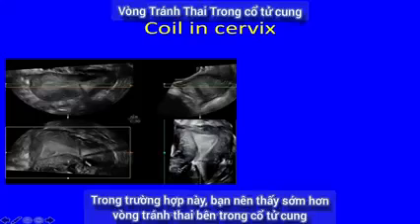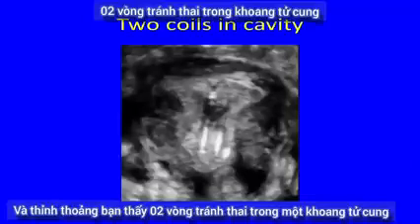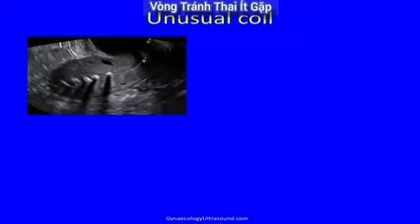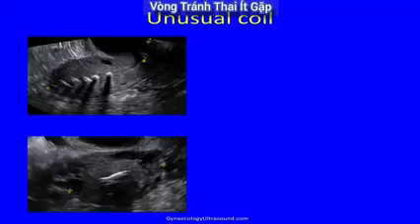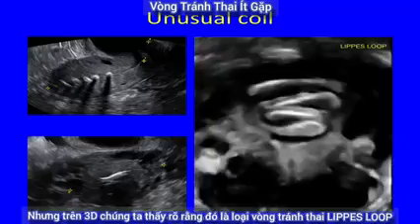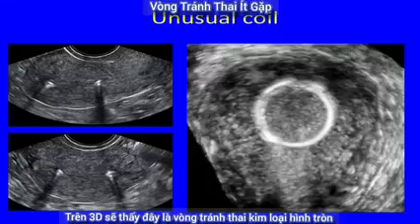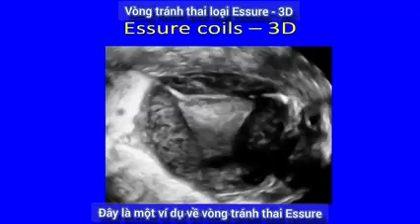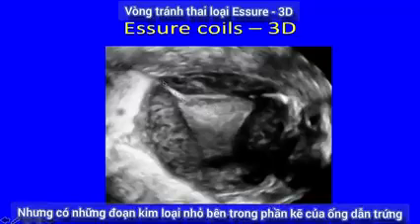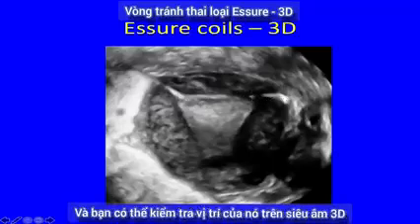In this case the coil is in the cervix. Sometimes you see two coils in a single cavity, or you see unusual coils. It's hard to know what this is on a transverse view, but on 3D this is a Lippes loop. In another case it wasn't clear what kind of coil this was, but this is a metal circular coil — and these are harder to remove. This is an example of Essure coils, which you don't see so much now — these are small metal inserts into the interstitial portion of the fallopian tubes, and you can check their position using 3D ultrasound.